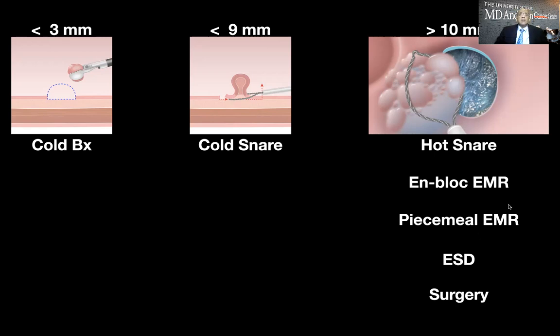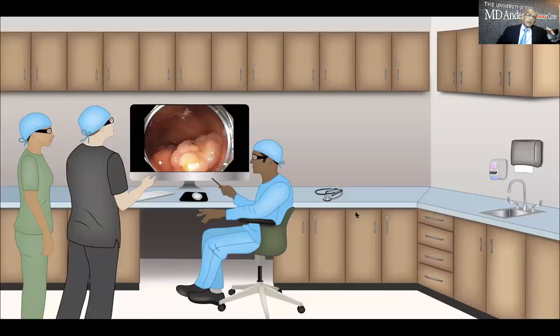You should also keep in mind the role of full thickness resection in some of the high-risk patients who cannot go for surgery. So this is what I do. I would like to now focus on endoscopic mucosal resection because the majority of the patients that we see in our practice can be managed with just two things, saline injection and a simple snare.